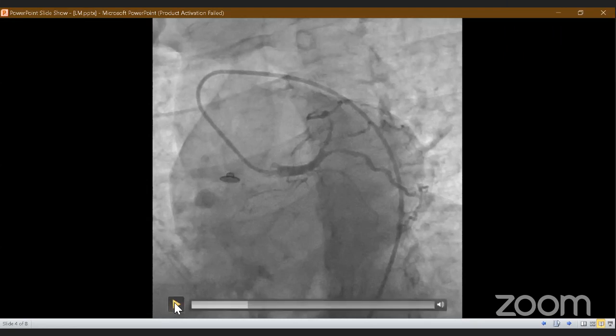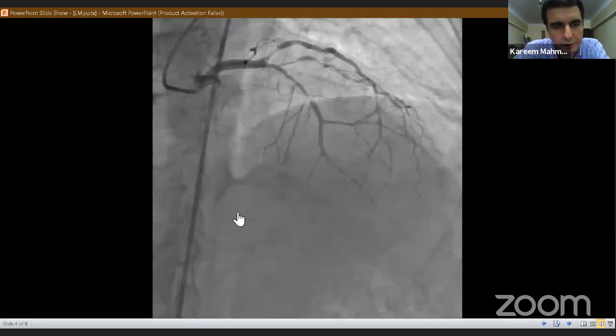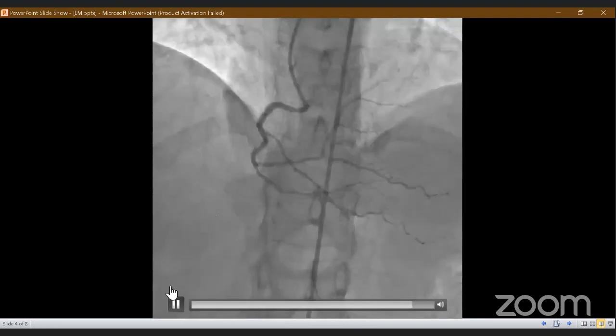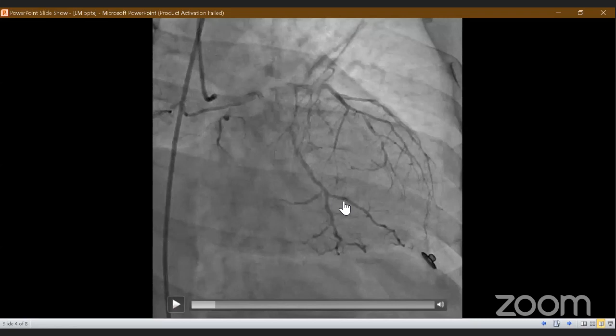Sorry, Dr. Ahmed Saeed, are we sure that we are dealing with a distal left main bifurcation, or is this an early diagonal and the circumflex is a very small branch that comes like 15 millimeters earlier? Okay, maybe. But look at the distribution of that vessel in the caudal view. It will come again here. So this distribution is not a distribution of a diagonal. At least, if you can say, it is a ramus, and that one is the LCX, but it is not a diagonal at this level in the caudal view.